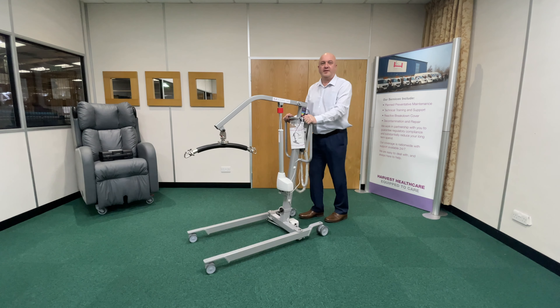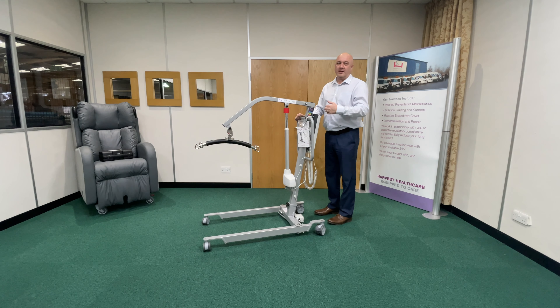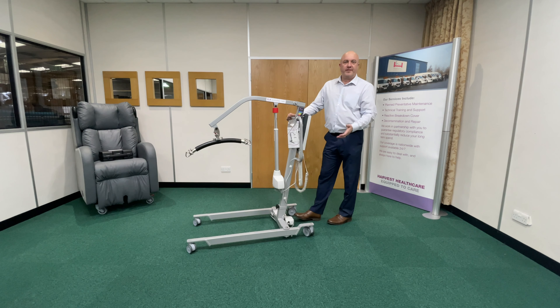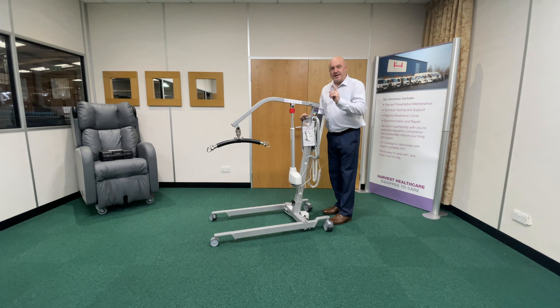Hoisting can cause quite a lot of injuries, and a lot of them are to do with moving the hoist — especially with a heavy resident, a heavy patient, or heavy service user — depending on where you're working, and it also depends on the flooring, carpets, and thickness of carpets. So, a couple of little hints and tips for you.